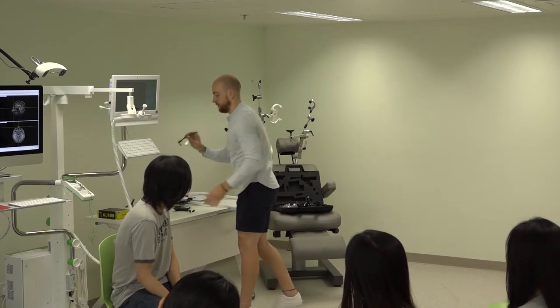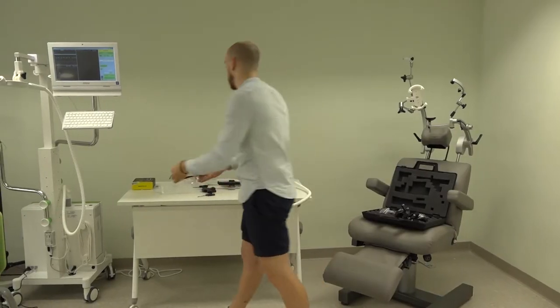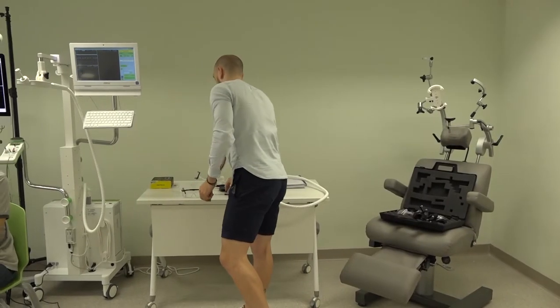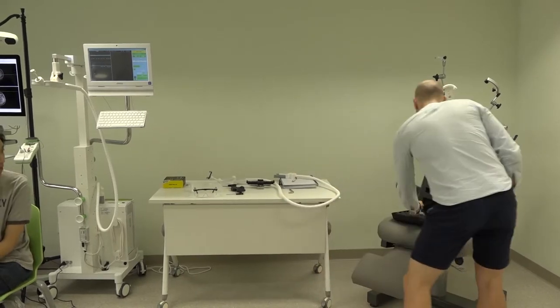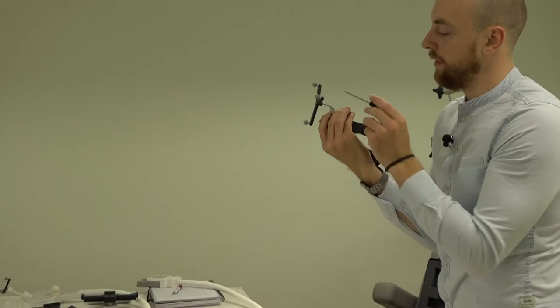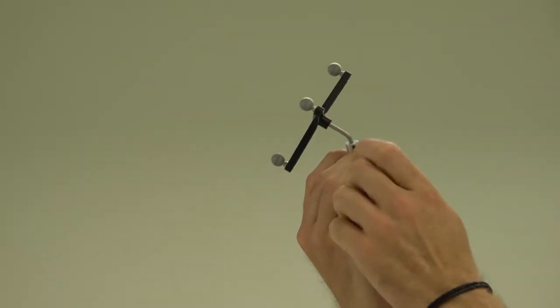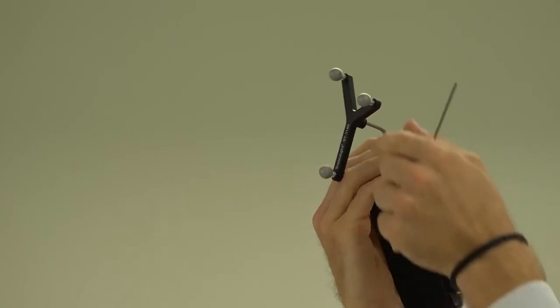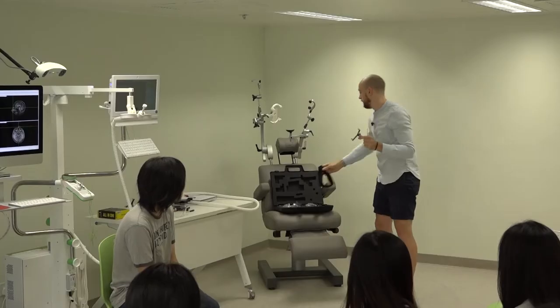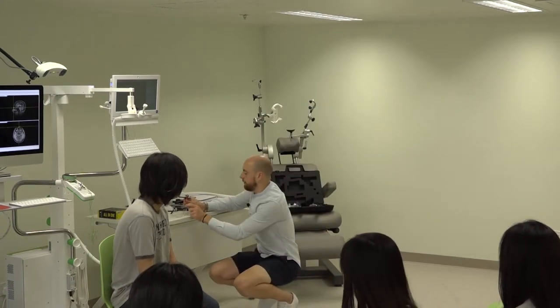So we've got the glasses there, and on there you've got each side to put in the coil tracker. You take your little Allen key, being careful not to touch those reflective dots. There's a little grub screw in there. So you want to undo that, and you can see that's just swung around. Take your hex rod out. Pop it back in there.